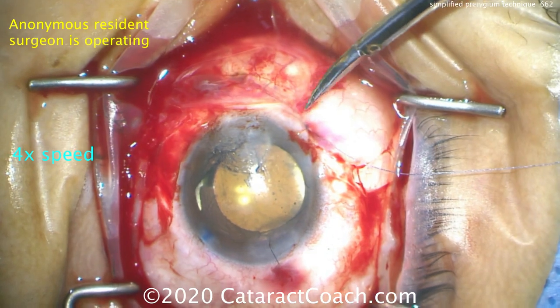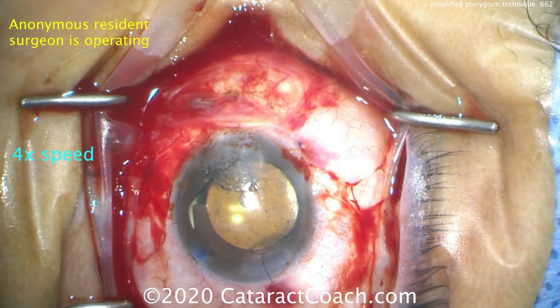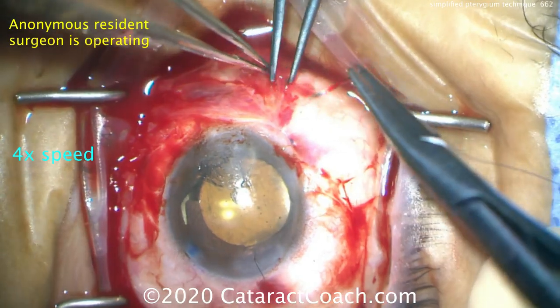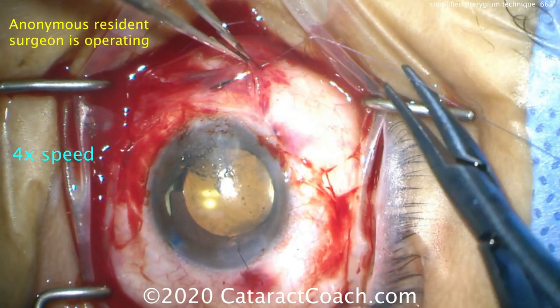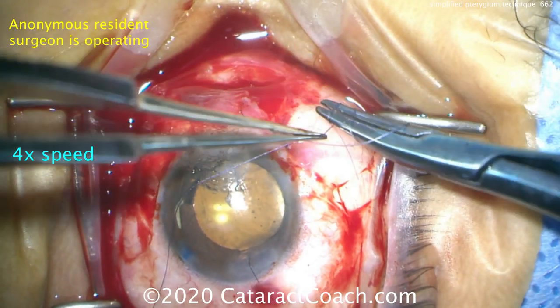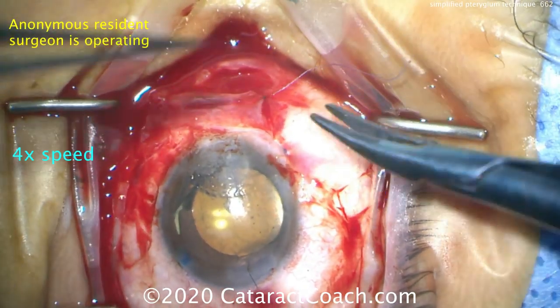Now we can still go back and smooth out the cornea a little bit more. There are fancier and prettier ways of doing pterygium surgery with amniotic membrane — you can do a free graft as well — but I want to show you a simple technique you can do even if you don't have these special supplies. The amniotic membranes can be quite expensive. Here's putting another suture, and you can see the conjunctiva closes beautifully.